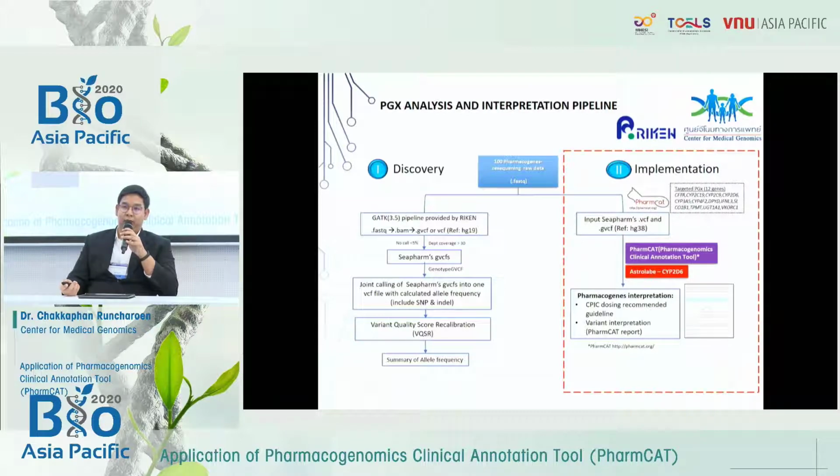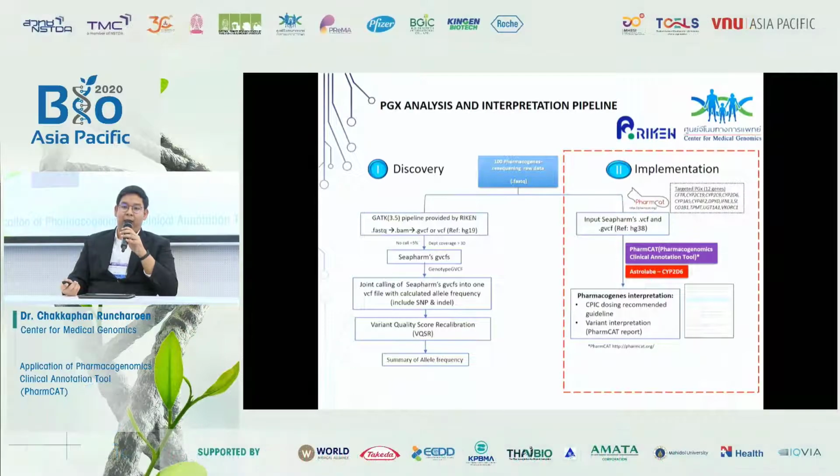For this project, the sequencing process was done by Riken, Japan. And the primary sequencing analysis was performed by the Center for Medical Genomics by applying the script which was developed by Riken, Japan.